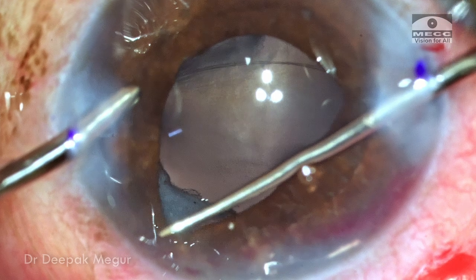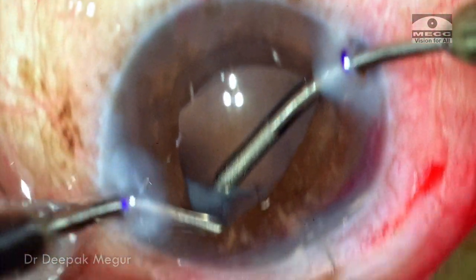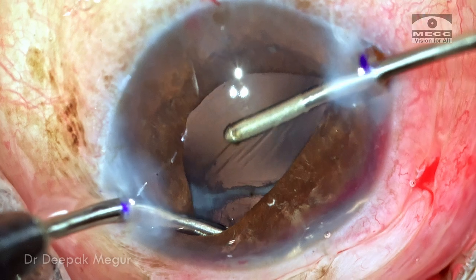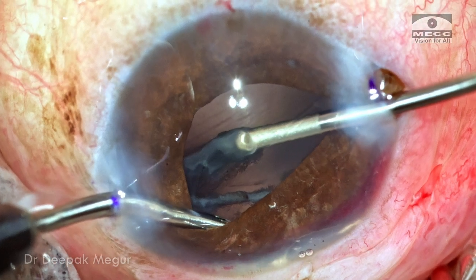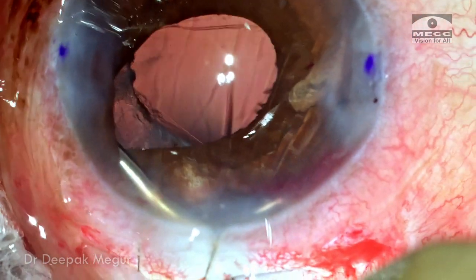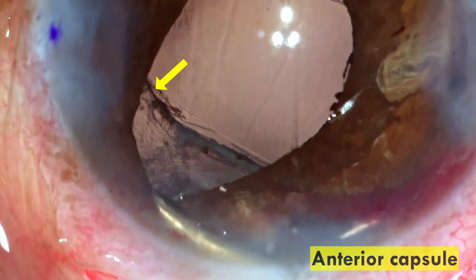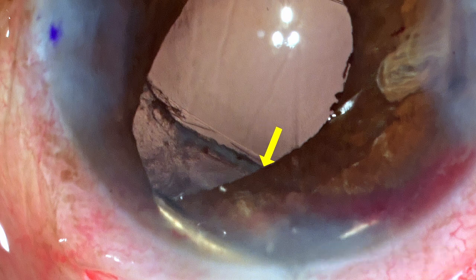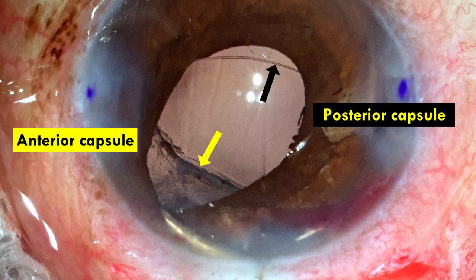Nevertheless, this was quite heartening and I thought it worthwhile considering a posterior chamber lens in the sulcus. With the iris retracted by the irrigation handpiece, I go in with bimanual aspiration to aspirate remaining cortex in this quadrant. It's a little cheesy and takes some time to pull out and aspirate. Retracting the iris with the irrigation probe to visualize any remaining cortex — there seems to be none, and the encouraging part is that I've got enough capsular support. This is the rim of the anterior capsule visible in the superior quadrant, so I'm going to place a posterior chamber PMMA lens in the sulcus with support of the anterior and posterior capsule.